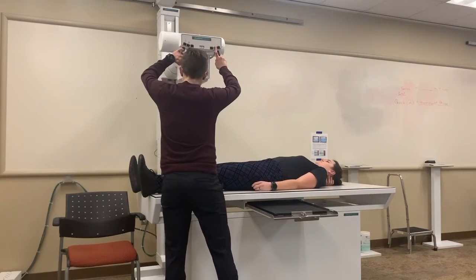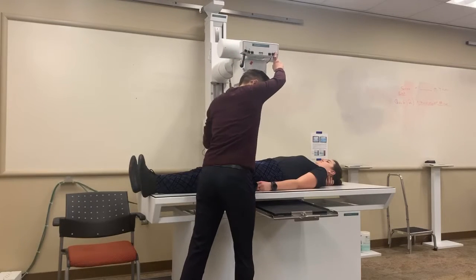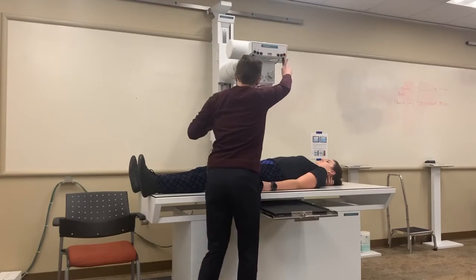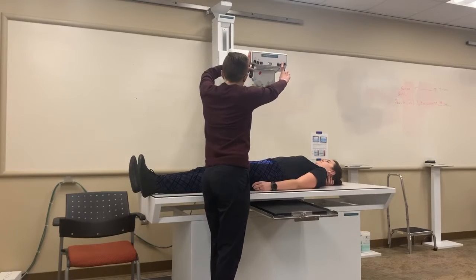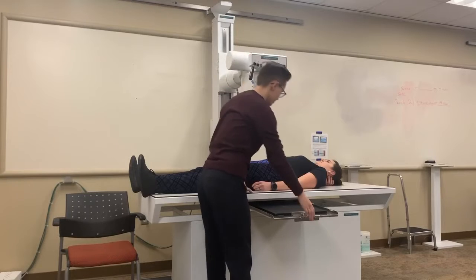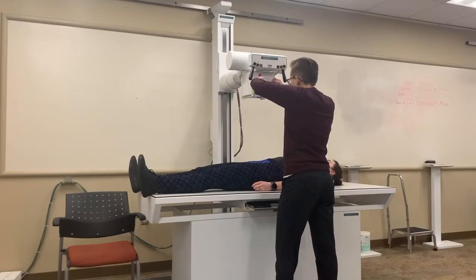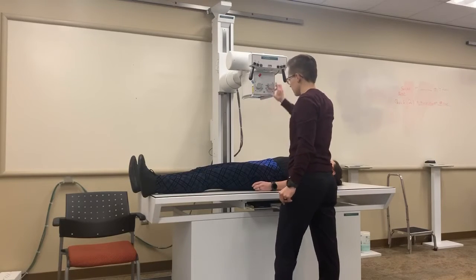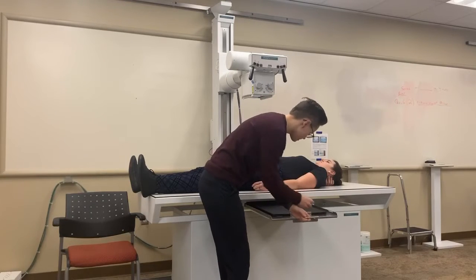I will line my central ray to that. And now we are at 40 inches image grid, not tabletop, on our column. I will open my collimation to 17 by 14, mark the anatomically correct side.